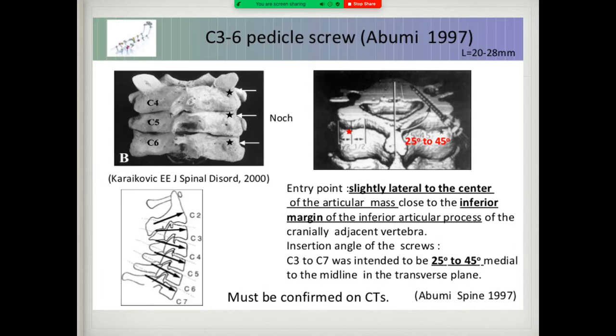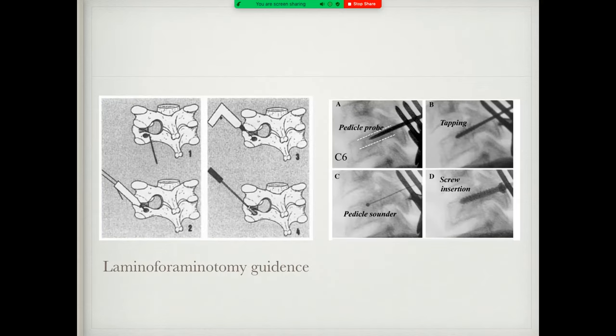I told you about this. We prefer to do a laminoforaminotomy, a small medial decompression that is very close to the medial border of the pedicle and also the lateral border of the lamina. That will expose the dura, and that also will expose the medial border of the pedicle. This medial border of the pedicle can be taken as your guideline. And then from there, you can do your pedicle screw fixation very safely. Now I'll show you this technique.